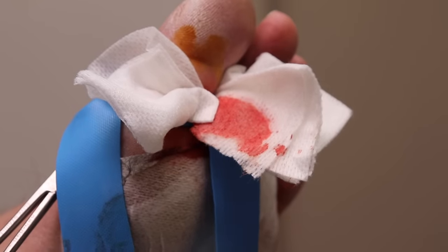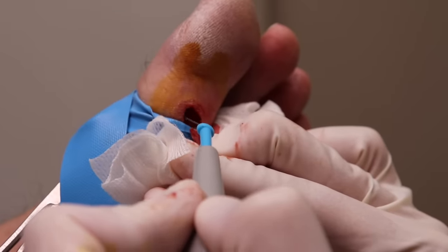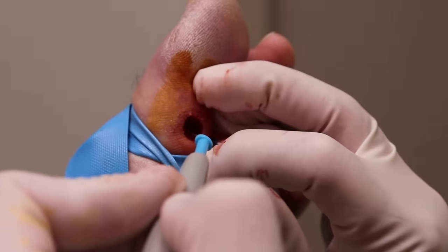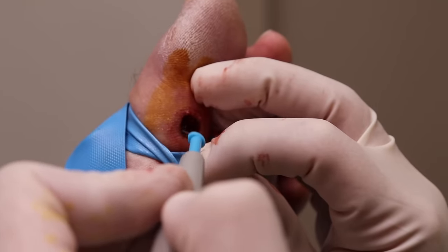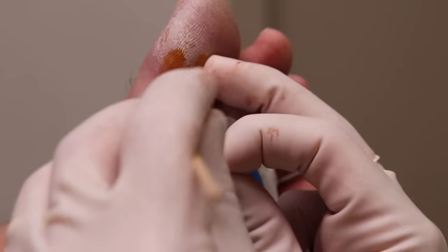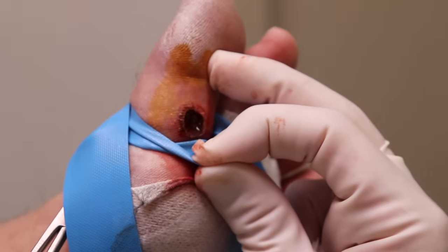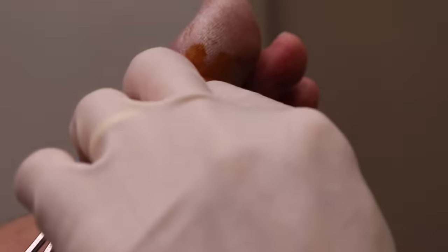What we're gonna do is apply the electricity and the acid, and the wart's finished. This also helps cauterize any bleeding, so it helps slow it down. We actually use this acid a lot on nail surgeries when I'm removing a toenail and don't want it to ever grow back. Because it's bleeding a little bit, we're gonna add a few more extra applications.